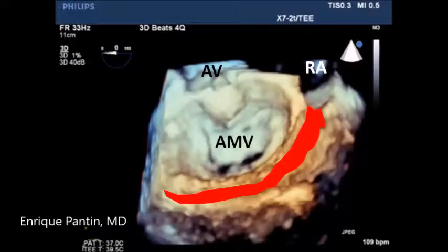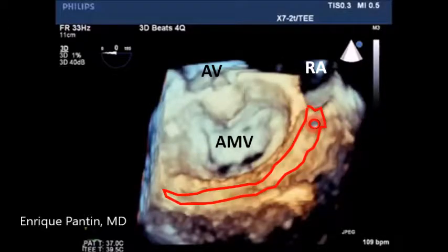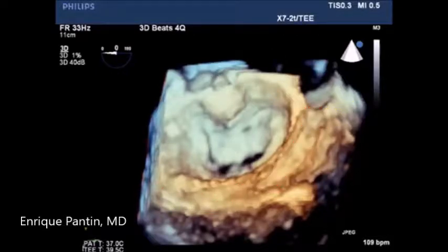Here we can see the whole body of the coronary sinus from its ostium to its distal portion as it converts into the greater cardiac vein. The yellow arrow points to the origin of the middle cardiac vein. Note how close it is to the ostium of the coronary sinus.